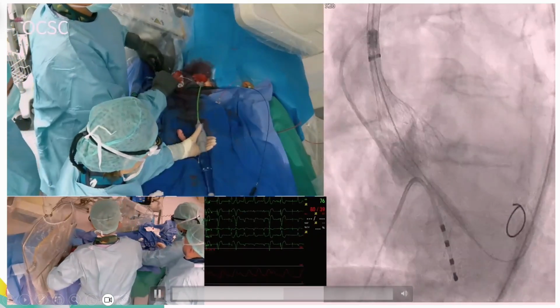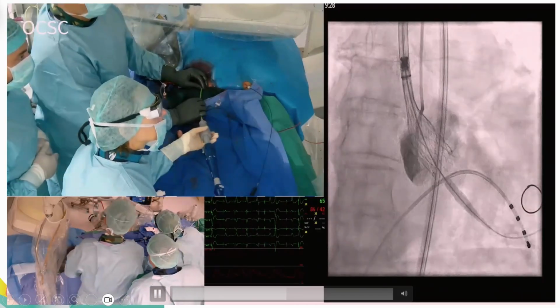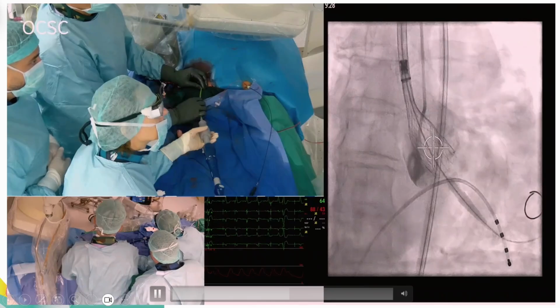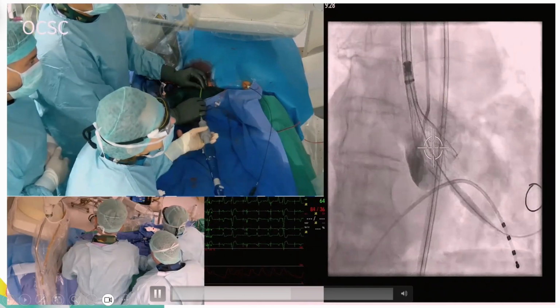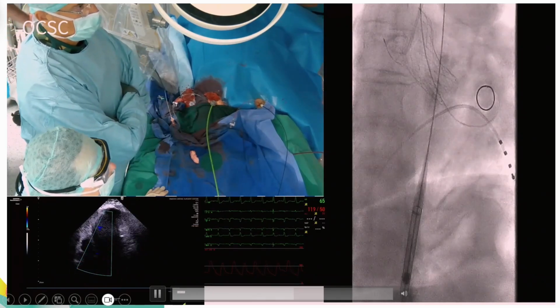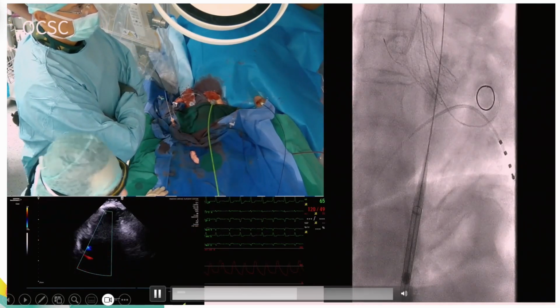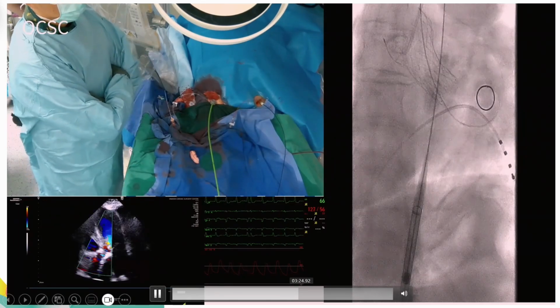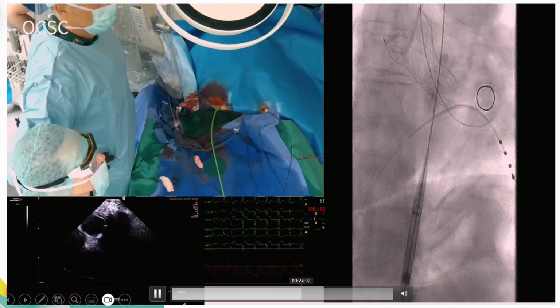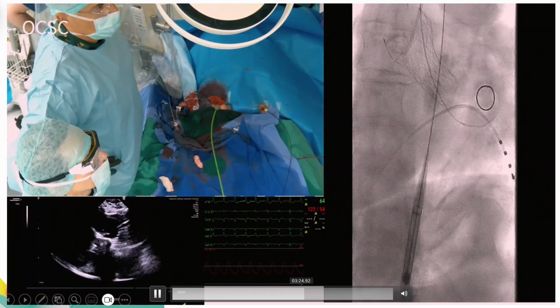Actually, this is the platform that we have the most experience with. It's a bicuspid valve. You have to pay special attention to the opening force as well as to the radial force. So it's the one that has, from the self-expanding platforms, the most open force. We are dealing with a lot of calcification extending to the LVOT. That's why we're reluctant to predilate a lot.